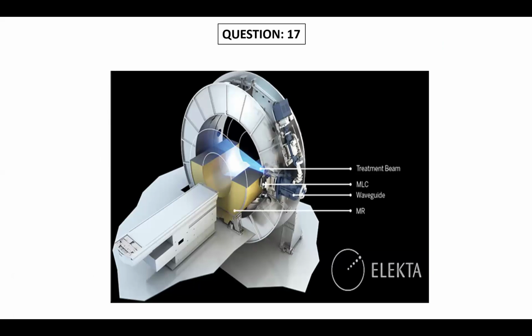So this is the MR-Linac, sir. Okay, good. So they have incorporated this MR along with the linac for the treatment, sir. Very good. What is the advantage? Sir, mainly this MR guidance will be there for real-time imaging. And it also has adaptive radiotherapy, sir.